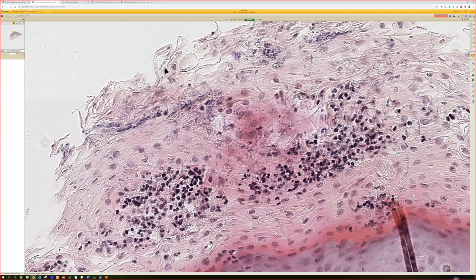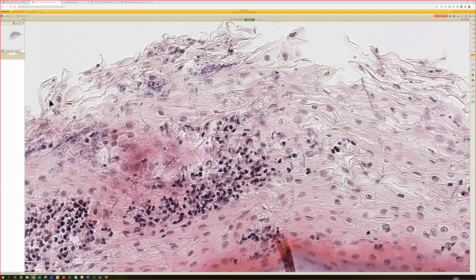The main thing I have trouble telling is, the one other thing that's helpful is that Candida has both yeast and hyphae or pseudohyphae, right? So you'll see elongated hyphal or hypha-like structures plus yeast, okay?